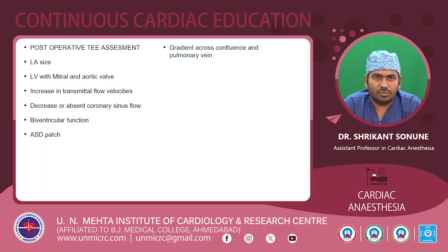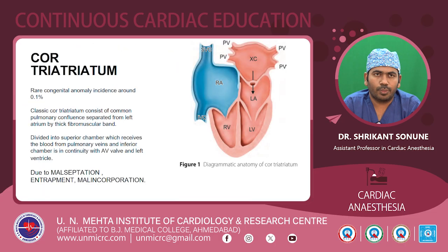So we have to assess the biventricular function, and we have to check the integrity of the ASD patch, and we have to make sure that there is no gradient across the confluence and that the individual pulmonary veins have unobstructed blood flow.